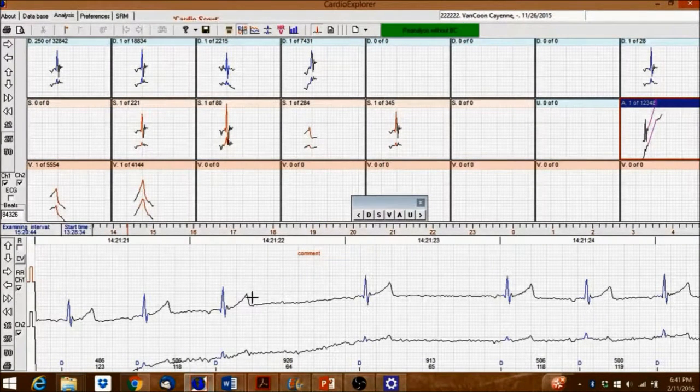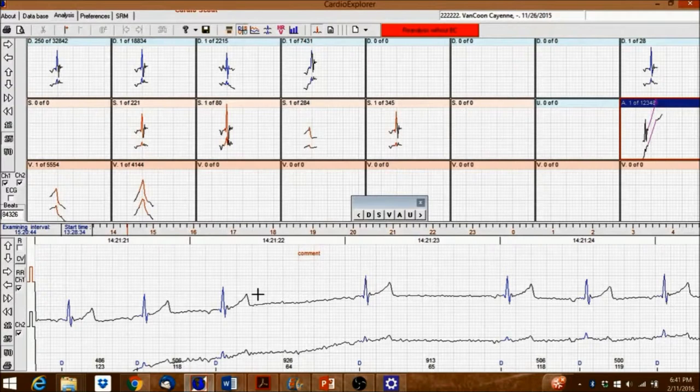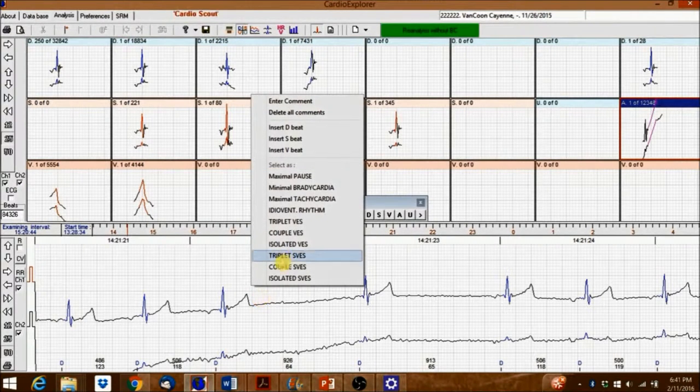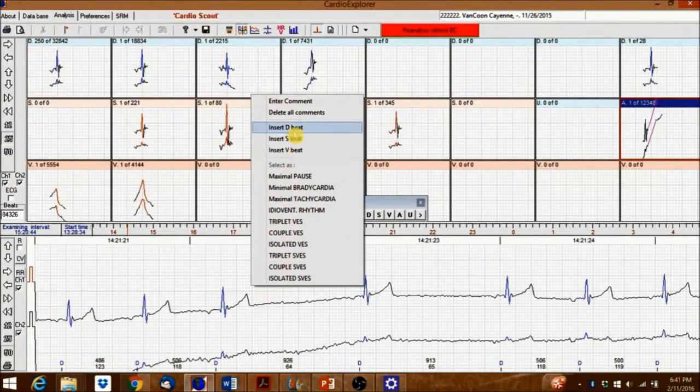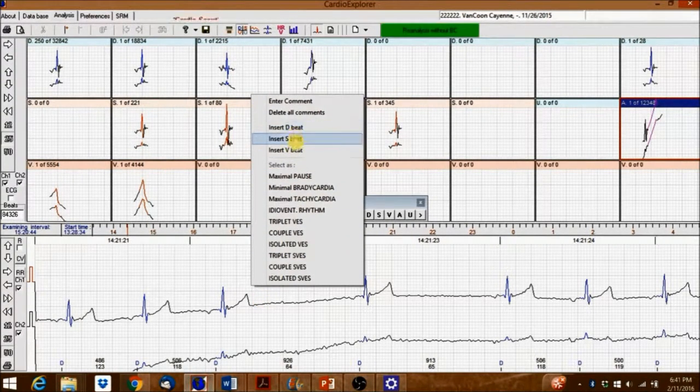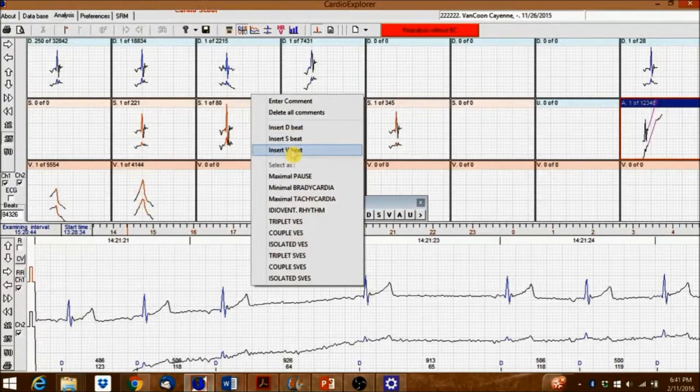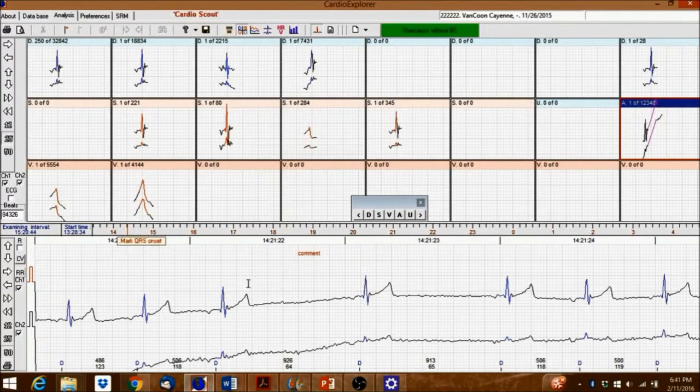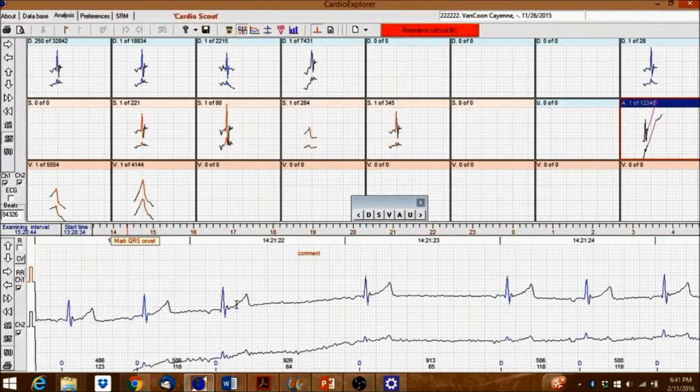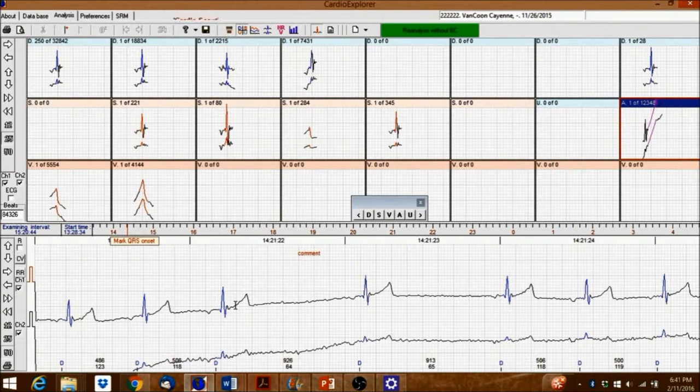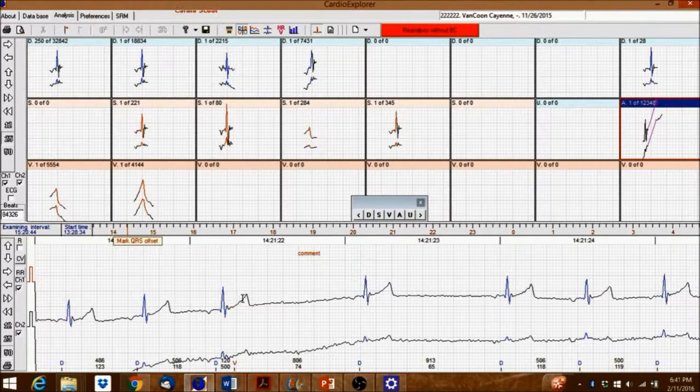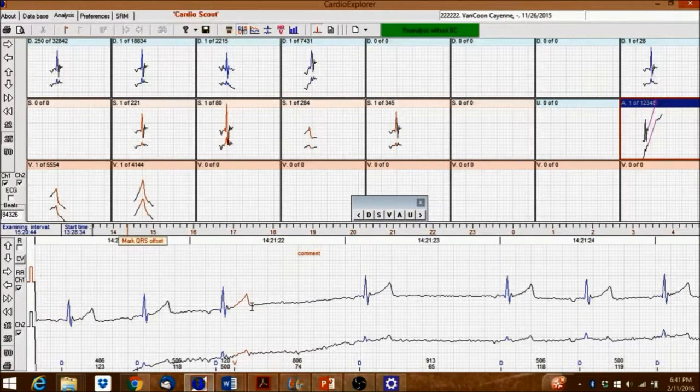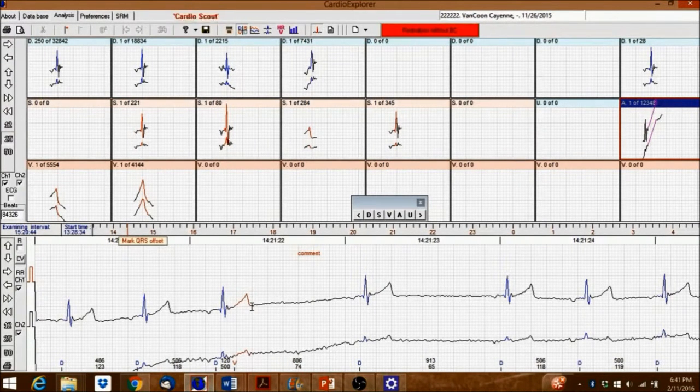Right-click again between the beats to open the menu. Select Insert Beat to insert a beat. Left-click to mark the beginning of the QRS. Mark the end of the QRS by left-clicking again.